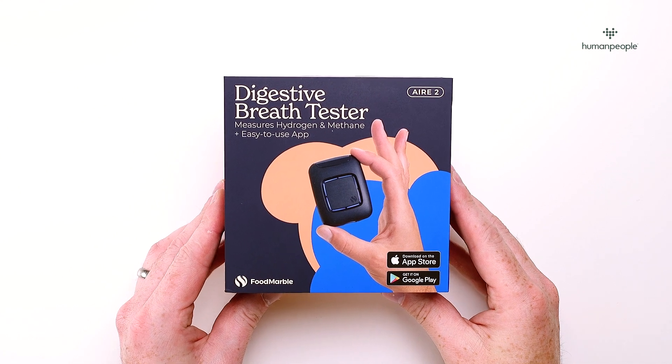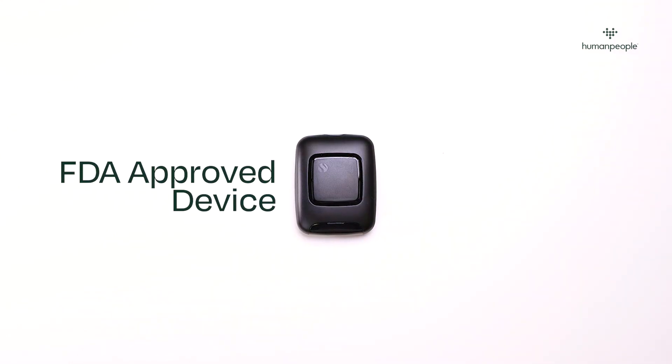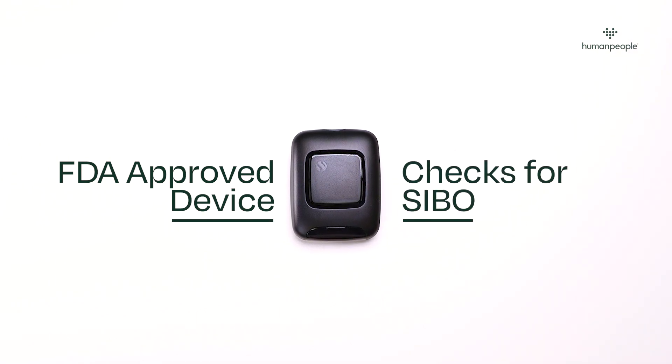Now your FoodMarble has arrived, we'll show you how to get it up and running. The FoodMarble device is an FDA approved clinical device which allows you to check for the presence of SIBO when linked to your HumanPeople account.